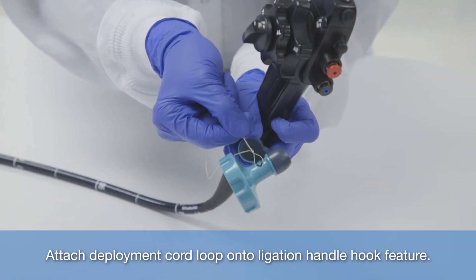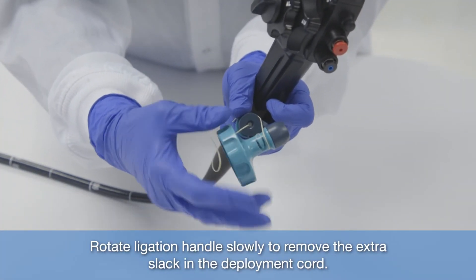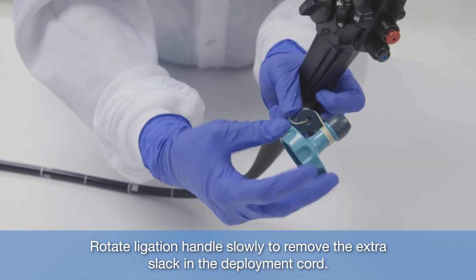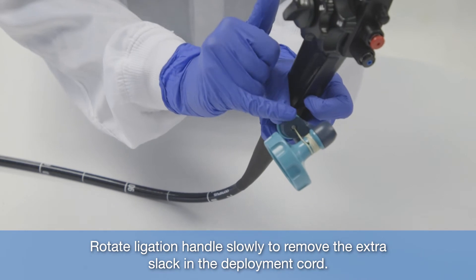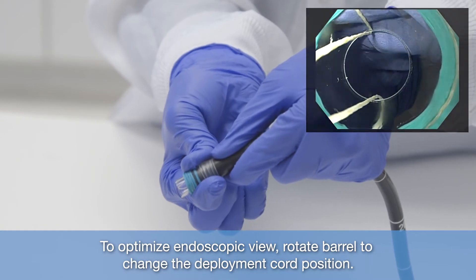Attach deployment cord loop onto ligation handle hook feature. Rotate ligation handle slowly to remove the extra slack in the deployment cord. To optimize endoscopic view, rotate barrel to change the deployment cord position.